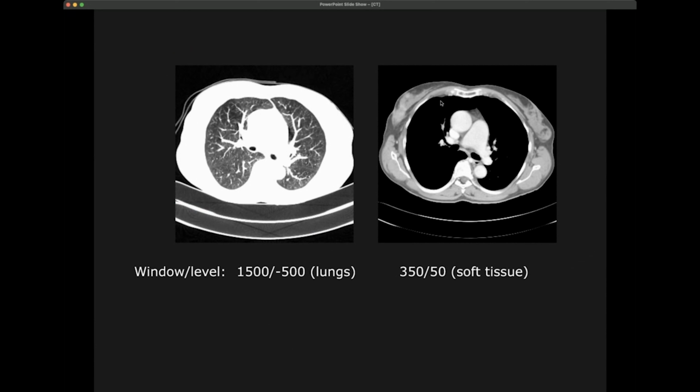So this is a typical CT image, a cross-section through the thorax. You see that the heart is in the middle. You see the bones in very white or bright, because as we said before, calcium and bone absorb X-rays quite a lot. So you see nicely the spine, and you see cut-throughs through the ribs. This is the shoulder blade. And you see immediately that the lungs are just totally black. There's nothing to see in the lungs because they're full of air, and of course, we can't display that.